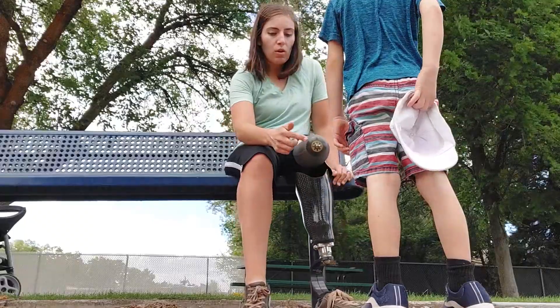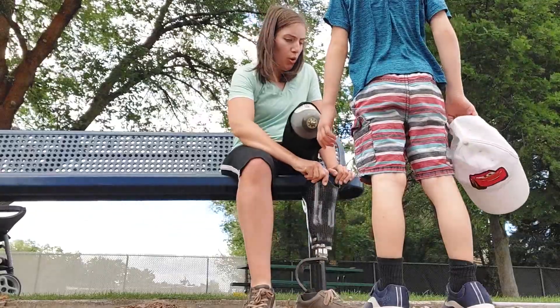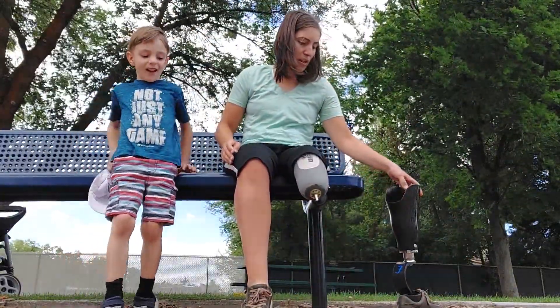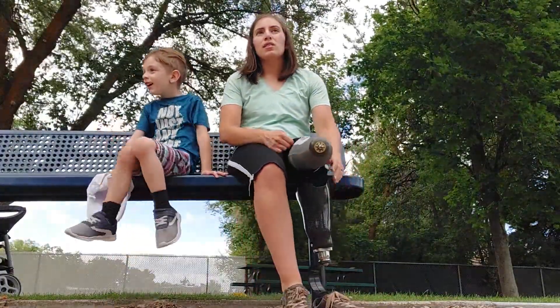And while that is a possibility, especially for above-knee amputees who don't have enough leg left to get a secure hold with a liner, if you don't have a need that warrants osseointegration, then there really isn't a point in locking yourself into that one option.